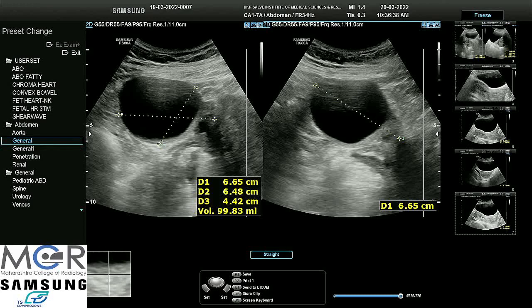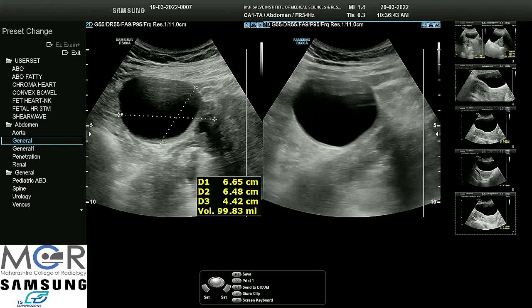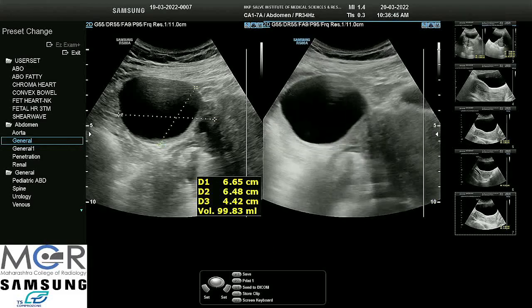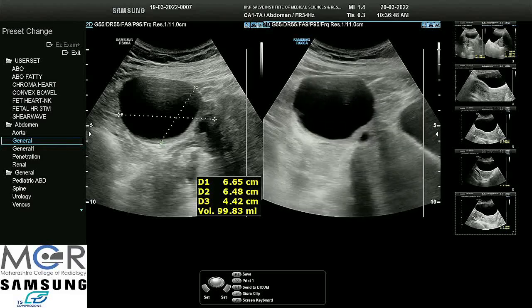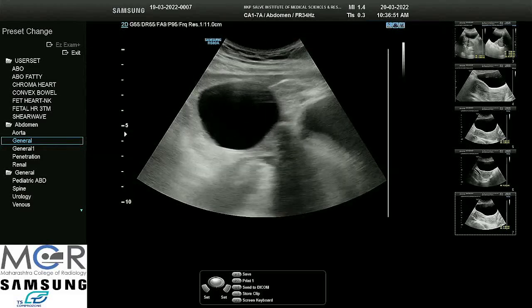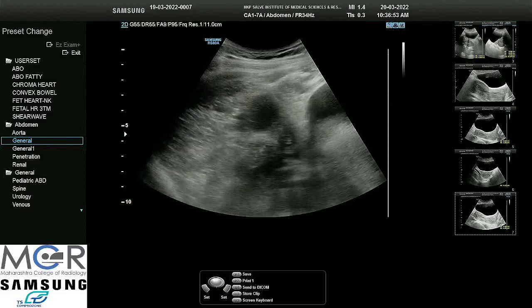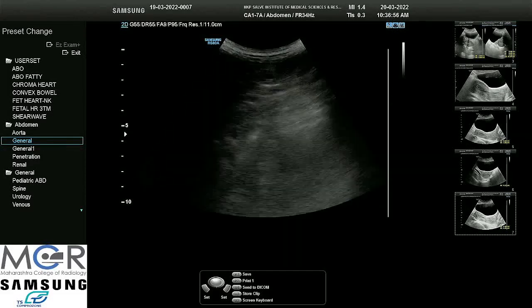While measuring the size of the ovary, I have taken into consideration the cyst as well. But while measuring the cyst itself, I will only measure the cyst and not take into account the ovarian stroma that is seen. This is a classic case where IOTA easy descriptors can be applied.